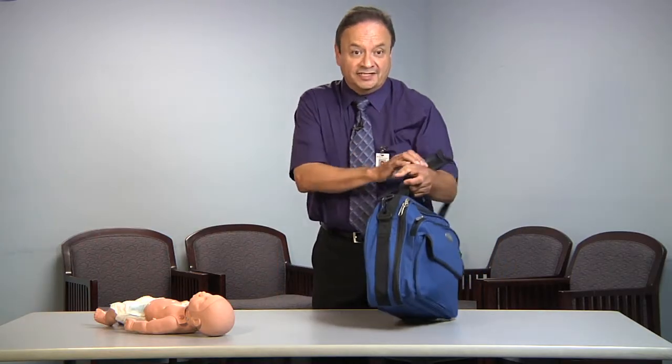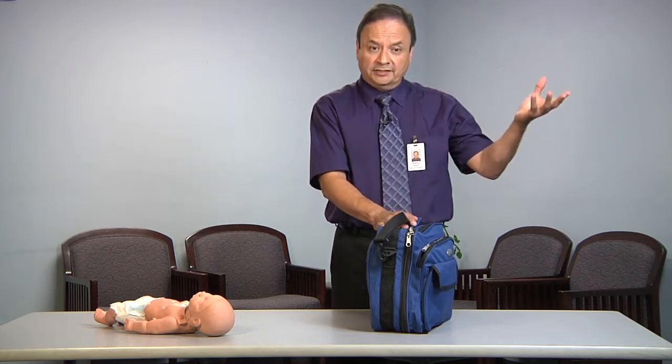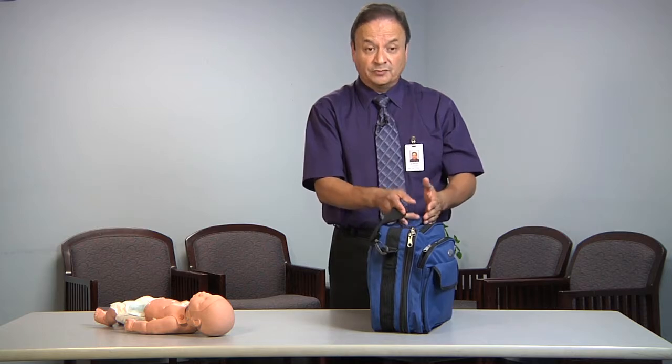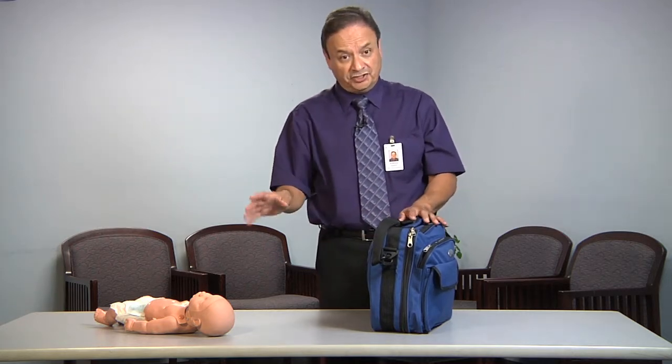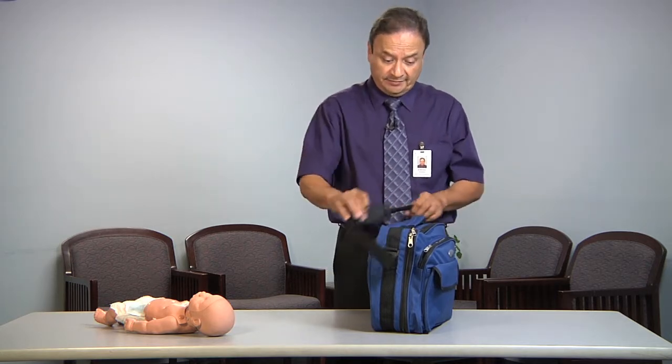The machine comes in a nice bag. We have to set it up properly, probably in a child's room or wherever you want. It is movable, transportable. The important part is we're going to find a strong table, not higher than the child, to set it up away from carpets and blankets and close to an outlet.